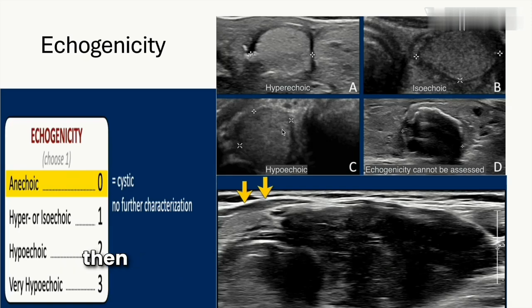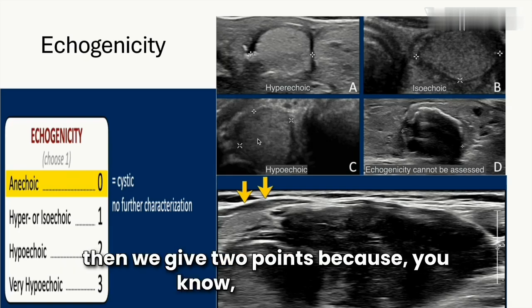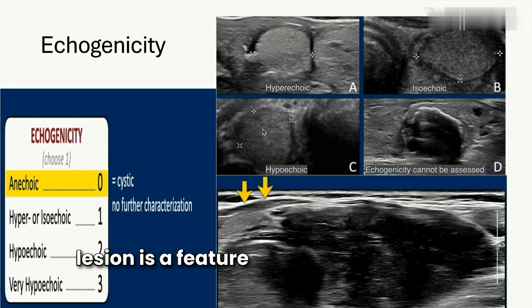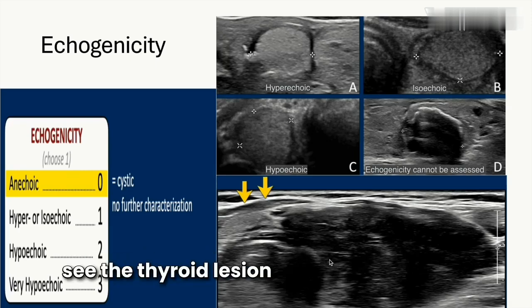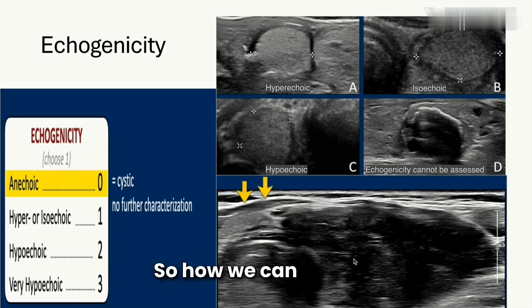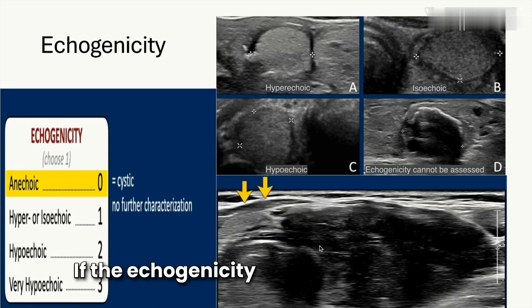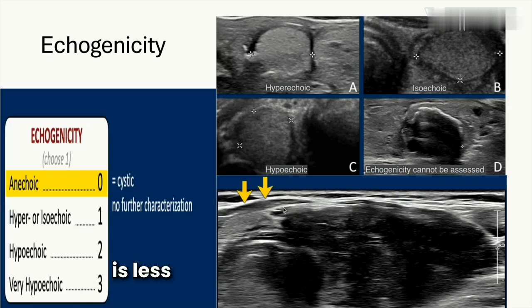If the thyroid lesion is hypoechoic, we give two points, because hypoechoic lesion is a feature of malignancy. In this image we can see the thyroid lesion is very hypoechoic. How do we determine it is very hypoechoic? If the echogenicity of the thyroid lesion is less than that of the adjacent muscles.